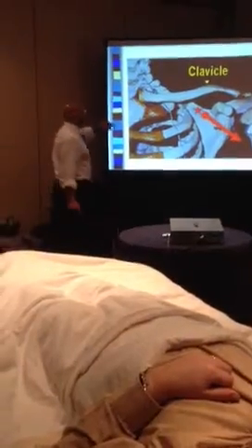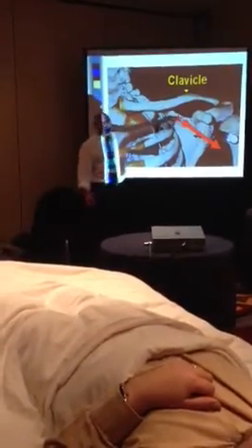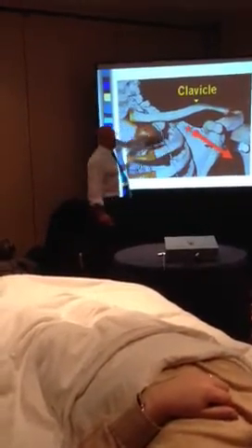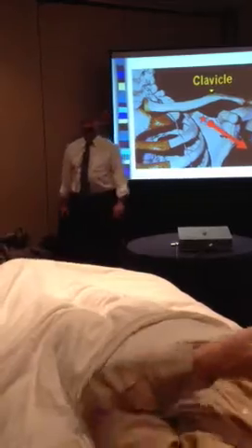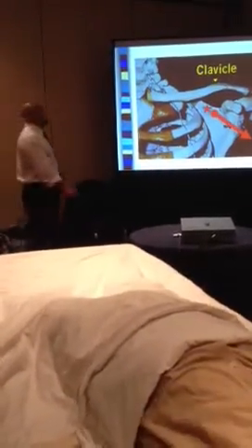Well, let's look at a skeletal model. Would everyone agree that if I put a needle 1 inch out from the midpoint of the clavicle, perpendicular to the clavicle, aiming it lateral to the pulsation of the artery, putting a needle here, aiming it here, then I'm outside of there. Hey, you know what? I'm starting to believe, about 92% convinced.